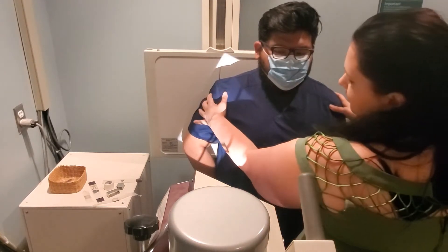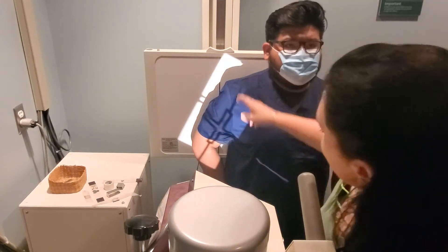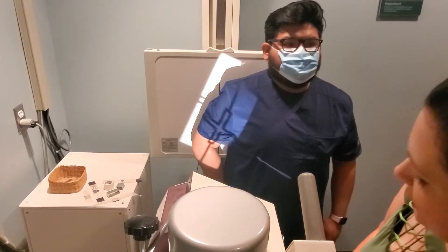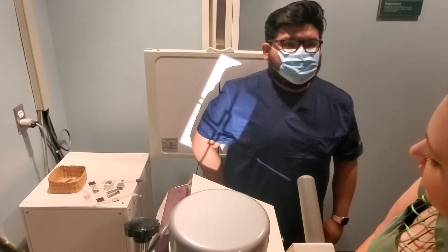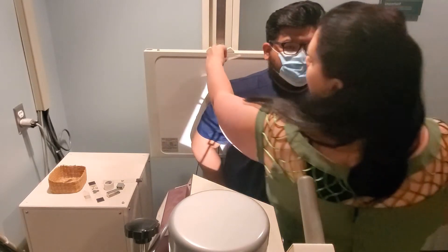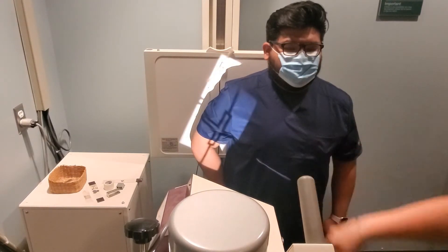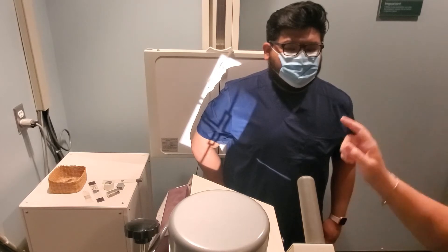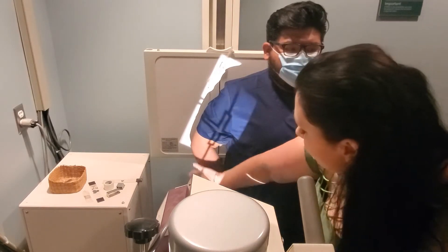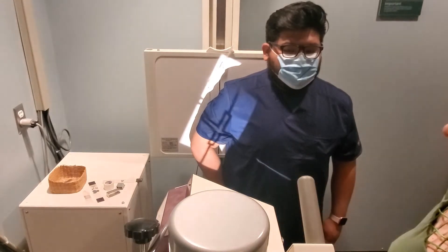Shift the patient slightly to compensate for the arm shifting. Make sure you're through the elbow joint and through the humeral head, and adjust your collimation as needed. Place your right marker in the collimated field so it shows up on the cassette — about a half inch on either side of soft tissue, and an inch and a half to two inches past the humeral head and elbow joint. Expose at 75 kVp, 12 mAs.